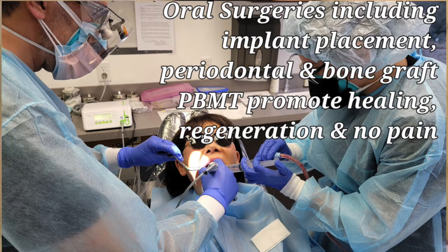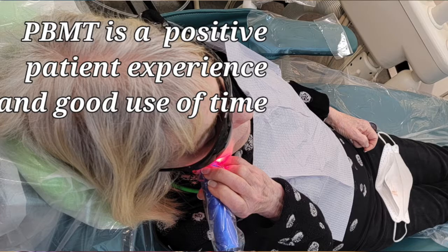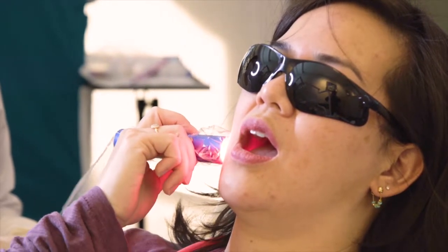It's great for oral surgery, root canal treatment, osseointegration, implant surgery, and post-op care for extractions like wisdom teeth. For all four quadrants, this would be great to use, and for any general dentistry it comes in handy. The take-home device is very easy and safe to use because the LED light is not a laser.